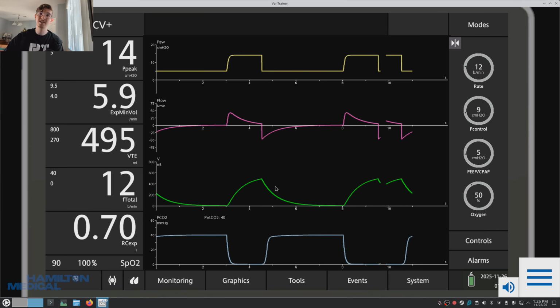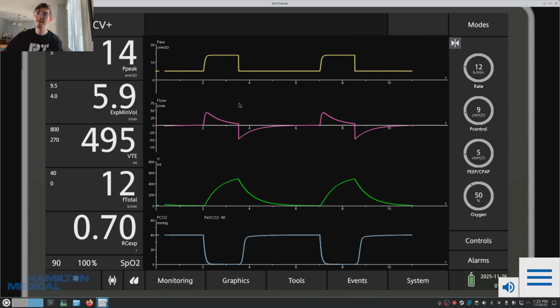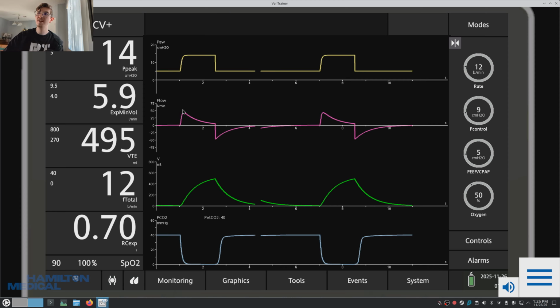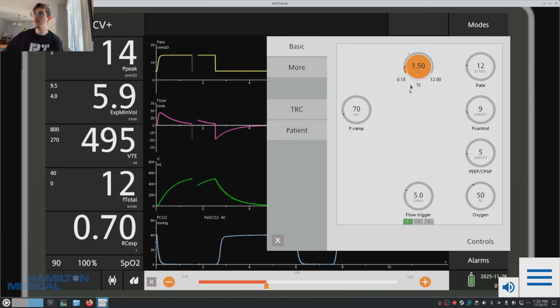That volume exerts a pressure back on the lungs. Now, as the pressure at the alveolar level increases, the difference between airway pressure and alveolar pressure decreases. As that difference decreases, the flow decreases, right? Until eventually, if we drag this out long enough, the flow will hit 0.